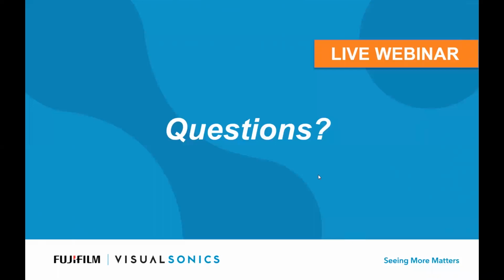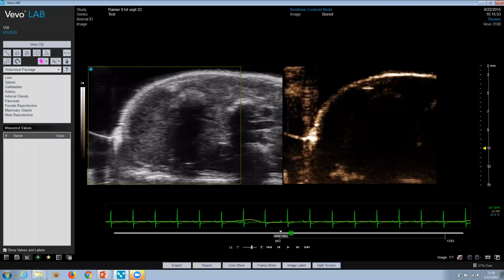One final question, because we are getting close to the top of the hour. There's a question about whether we can sort the study manager by animal ID or by some of the other functions. The short answer is no, not right now. That is something that we have thought about.